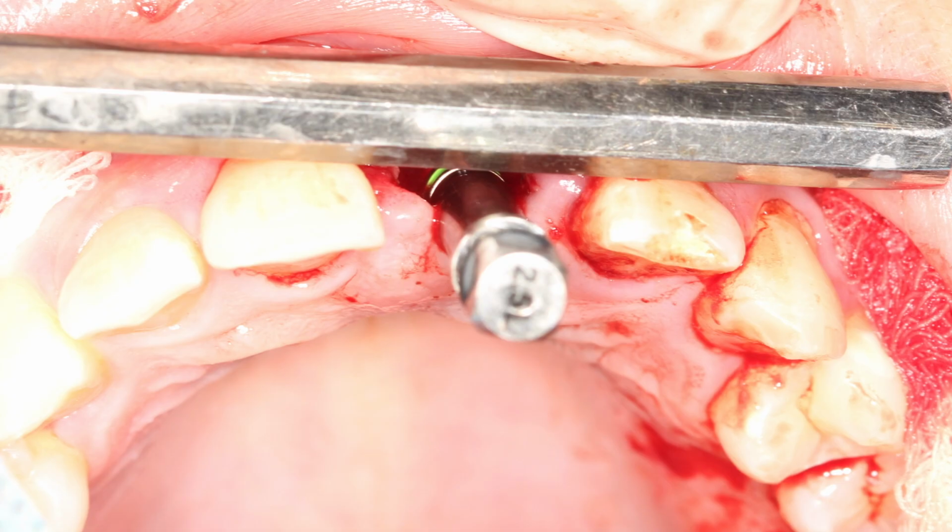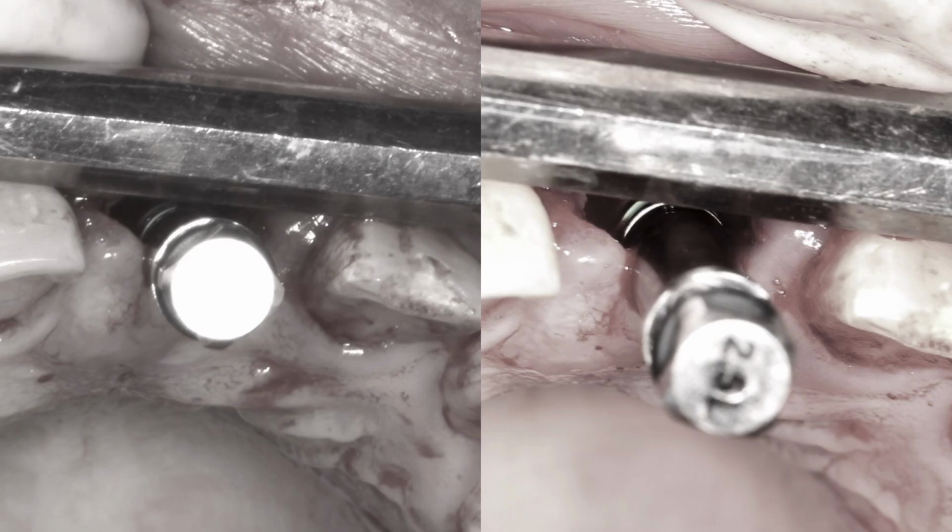And this is after several minutes of struggling and removing the implant, replacing it, maybe a little bit more osteotomy, how we were able to change the trajectory without losing the primary stability. So this photograph shows the difference that we have achieved.